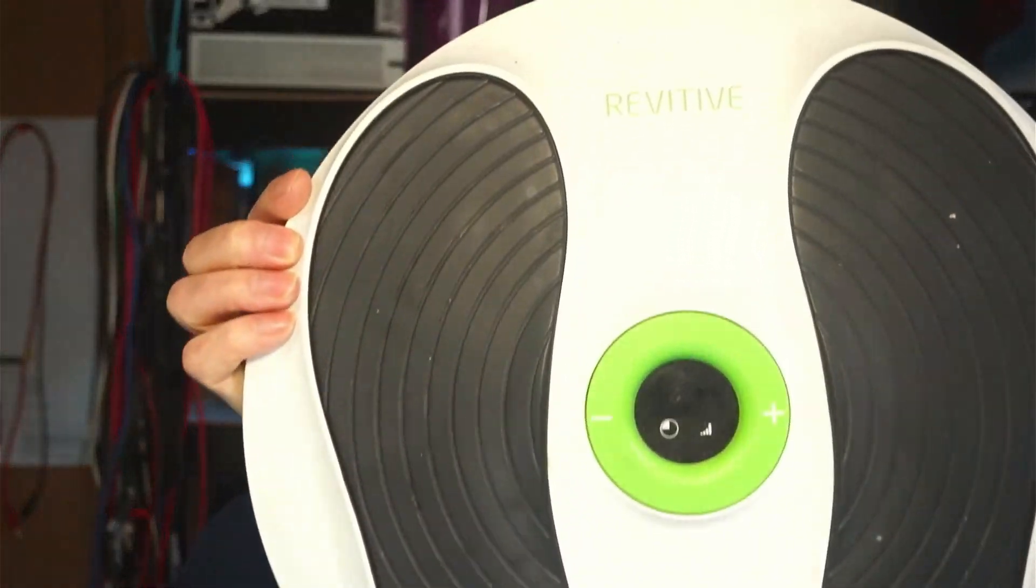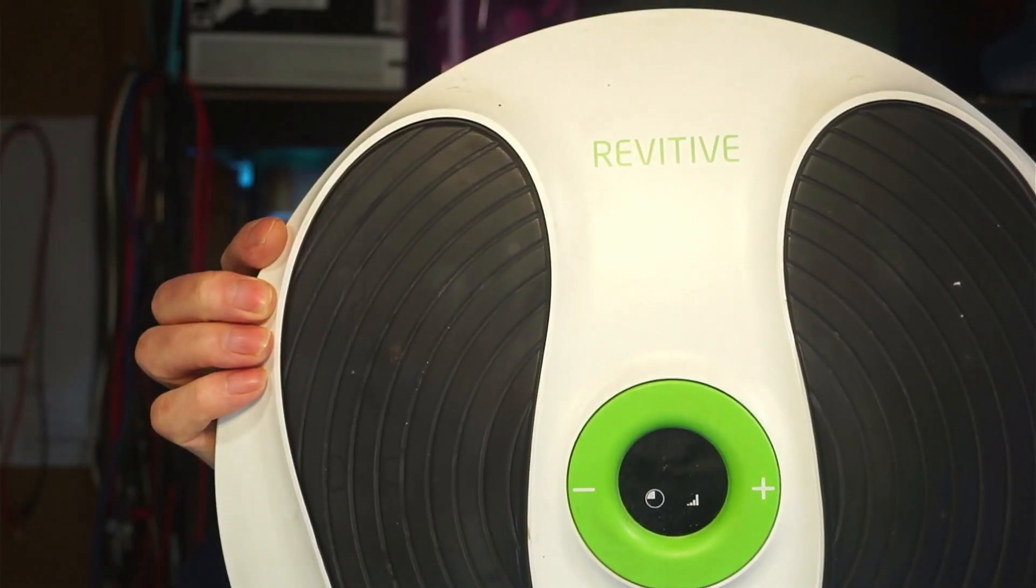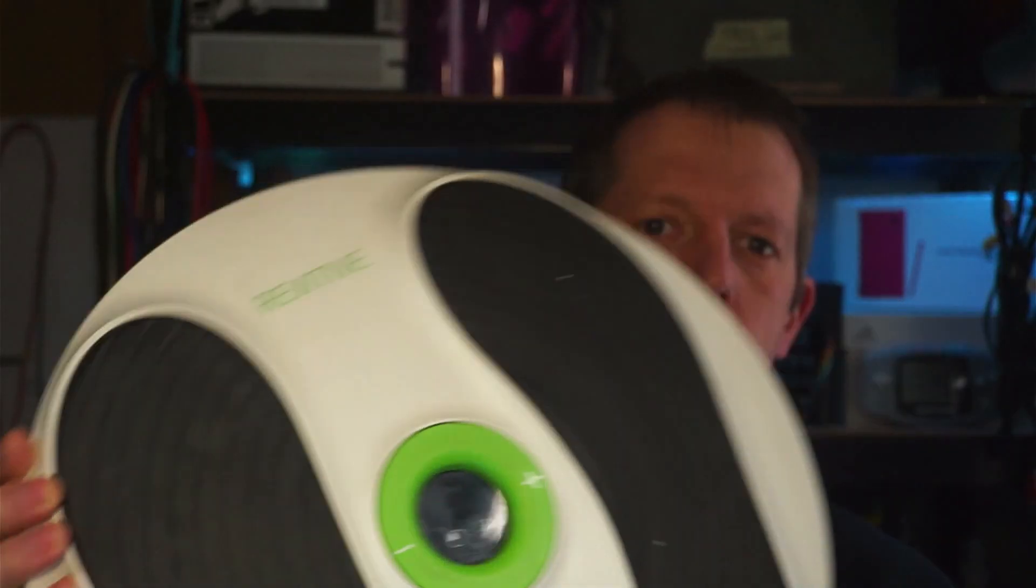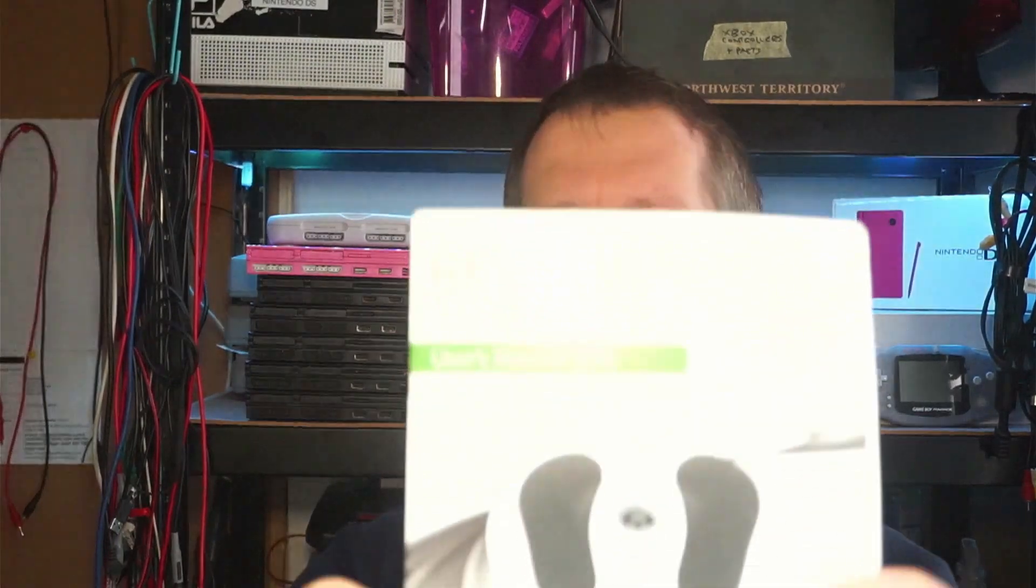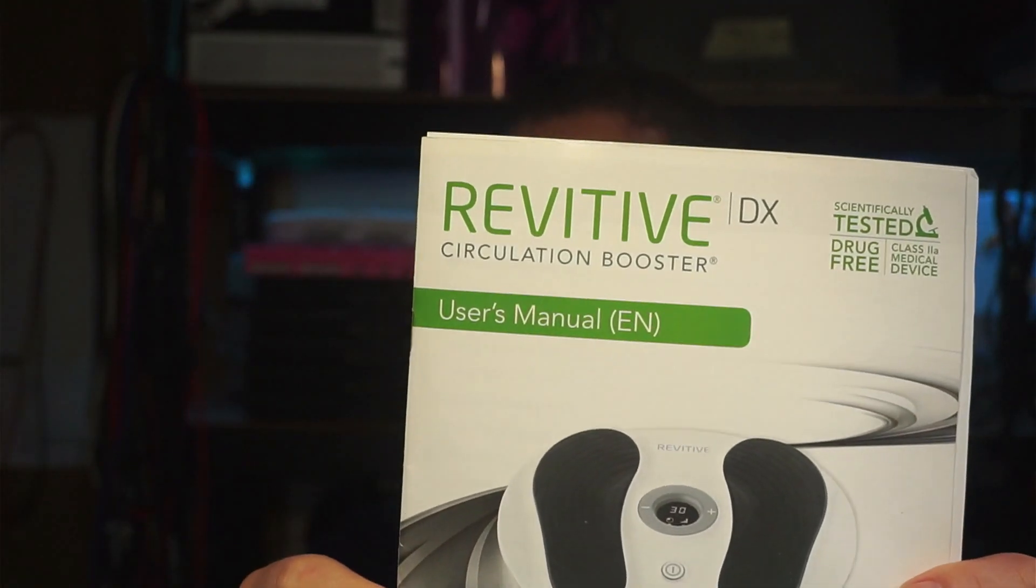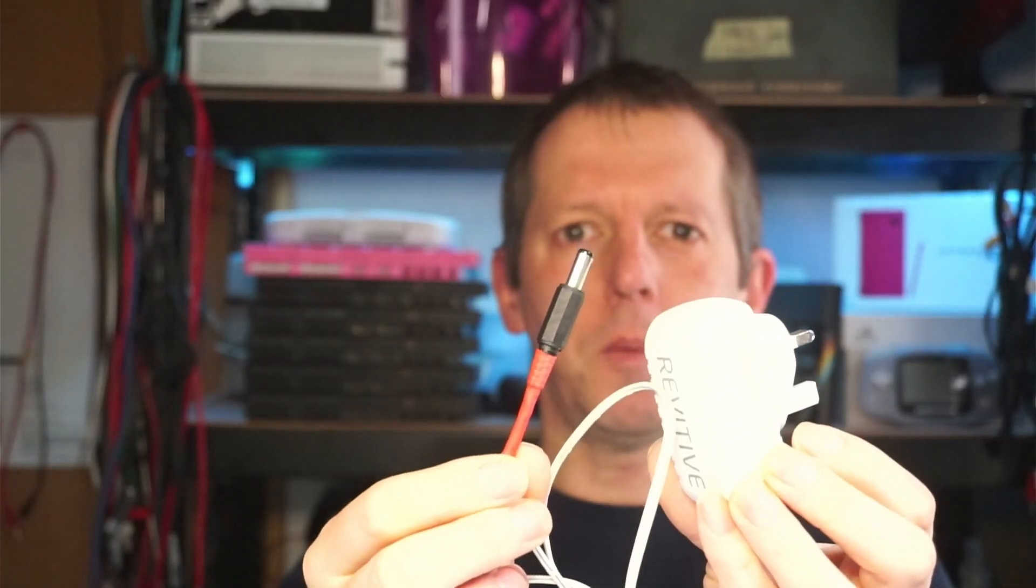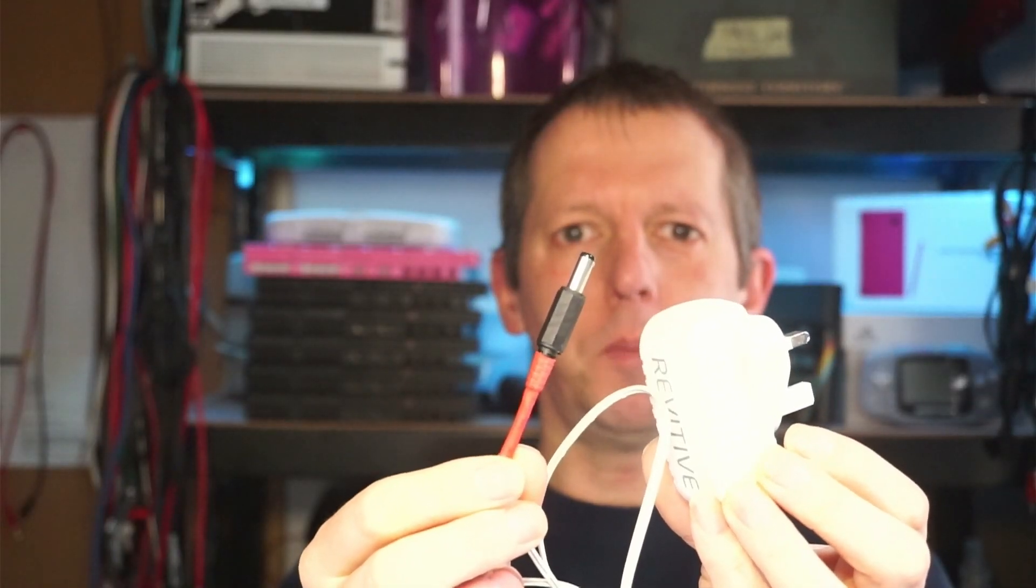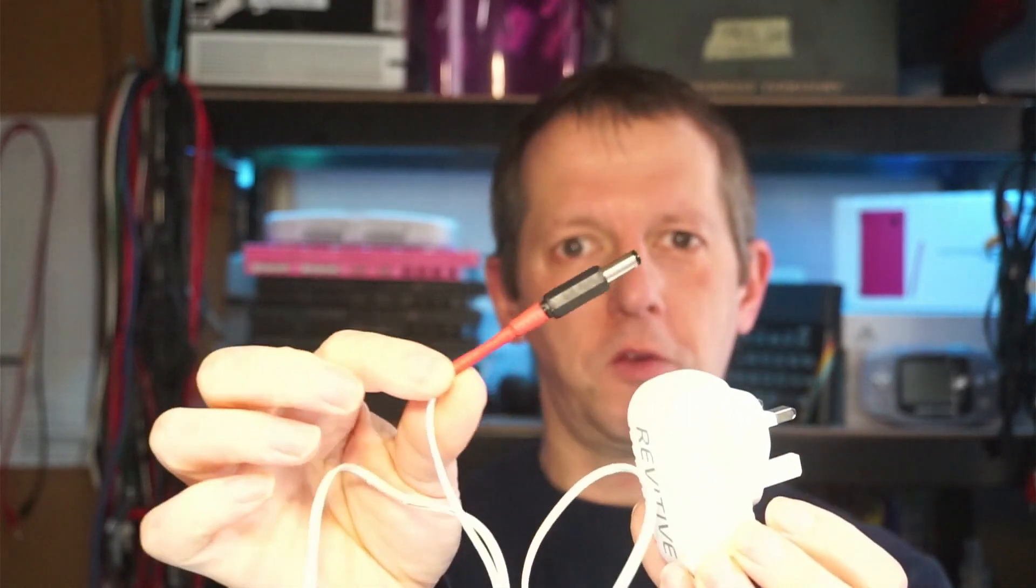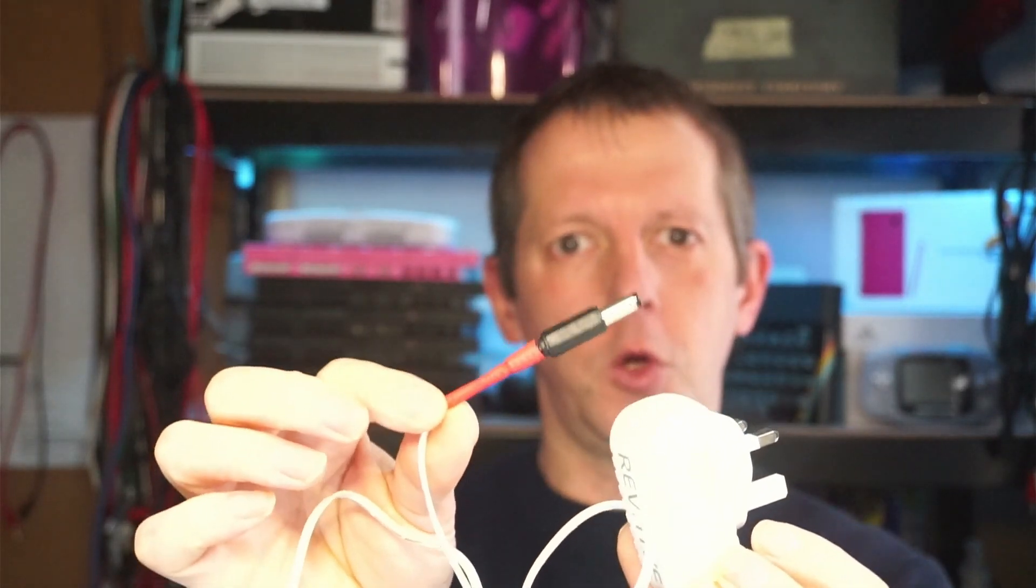Hello, it's me Philip. Today I am working on a Revitive circulation booster. This is for a family member. She asked me to have a look at it. She'd snapped the end off the power supply, so this is the new one that I've put on for her.